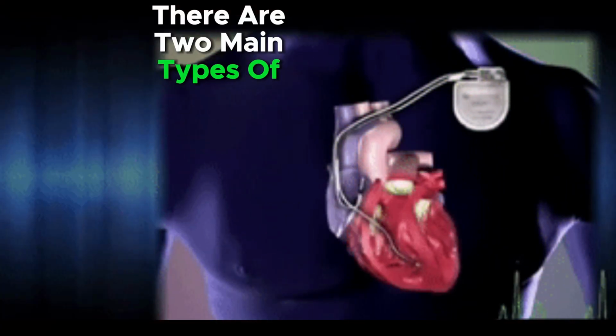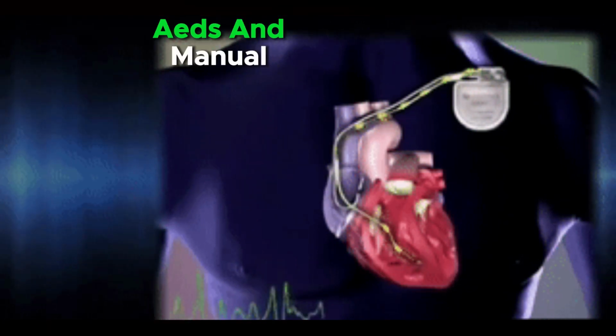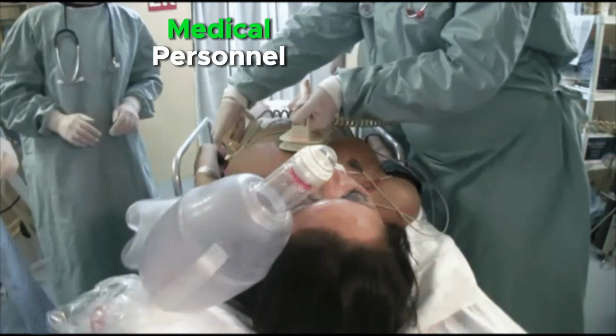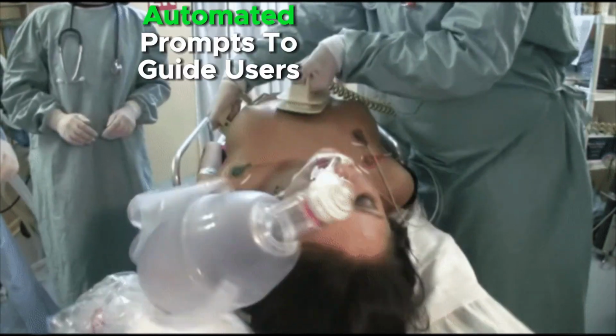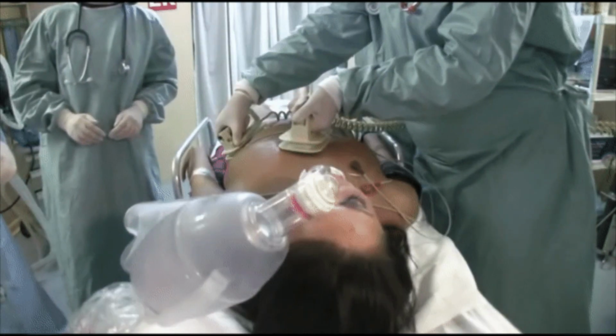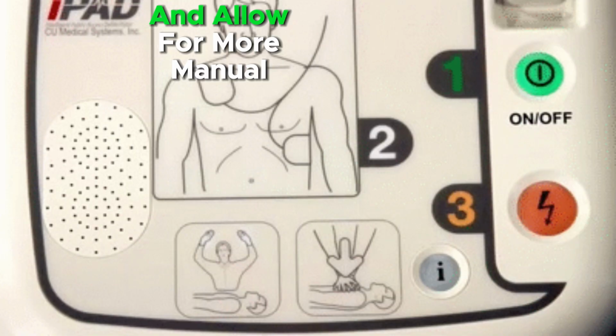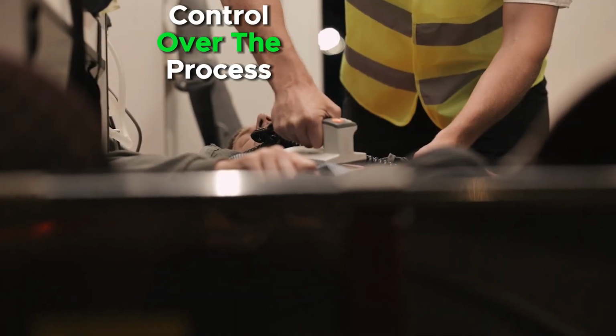There are two main types of defibrillators, AEDs and manual defibrillators. AEDs are designed for use by non-medical personnel and provide automated prompts to guide users. Manual defibrillators are typically used by trained medical professionals and allow for more manual control over the process.